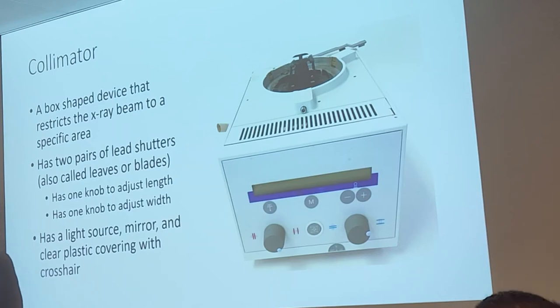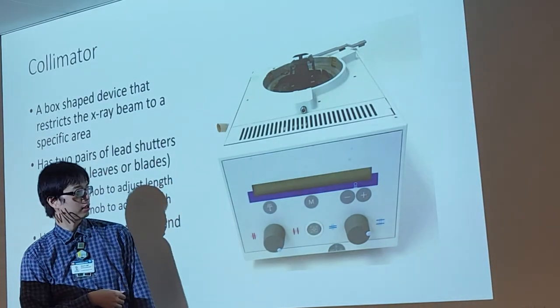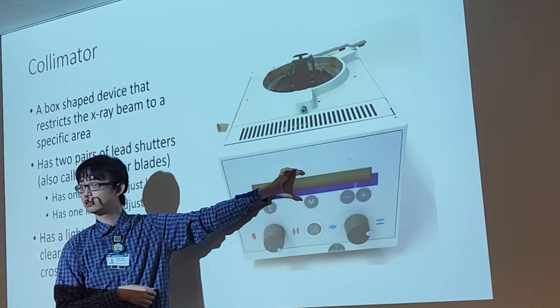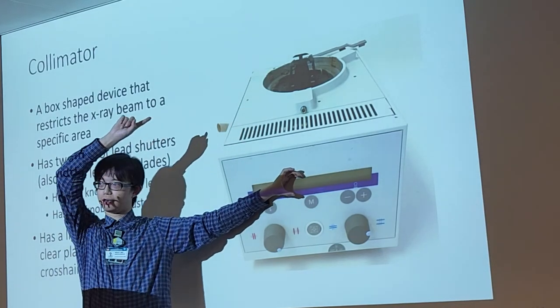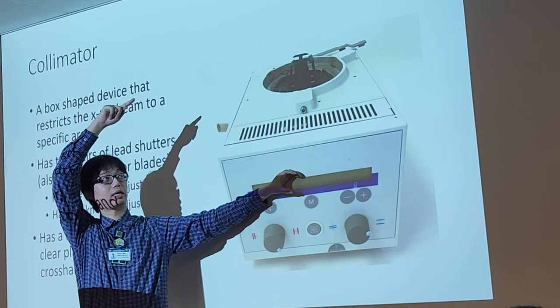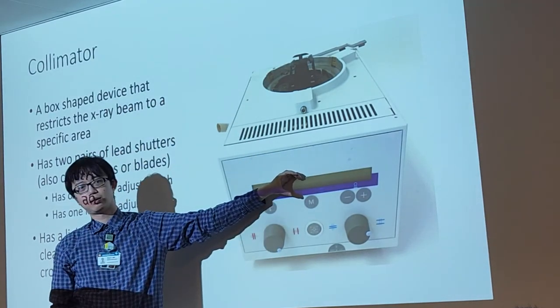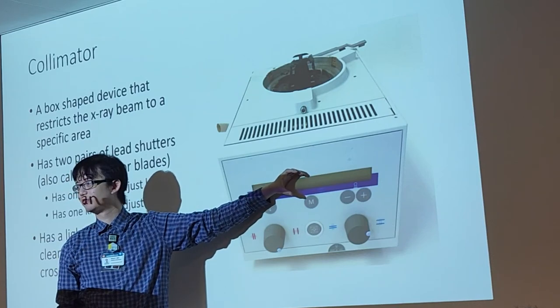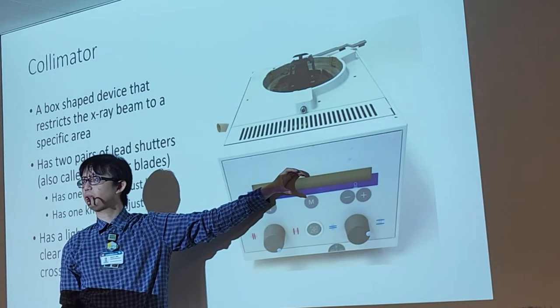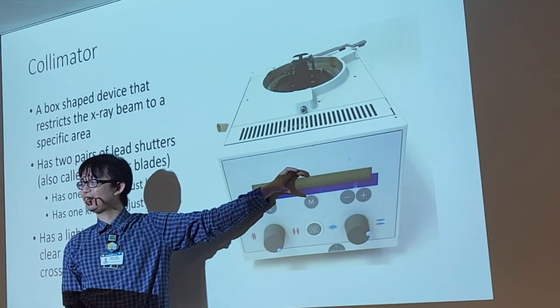All right, so let me ask you something. So here's our collimator, right? Light comes out straight down this way, correct? All right, so let's say that the light bulb's right here in the middle. What's above the collimator again? The tube, right? What does the tube do? It shoots the X-rays, right? So the X-rays come out of the tube, they come down here through the collimator, and they come out. So what are the X-rays going to pass through? The light bulb. So do you want your pictures with a light bulb in the middle of every single person's chest? No, that doesn't sound good, does it?